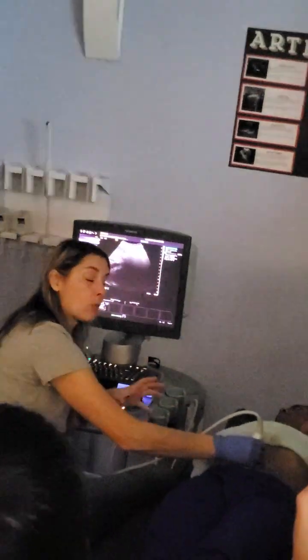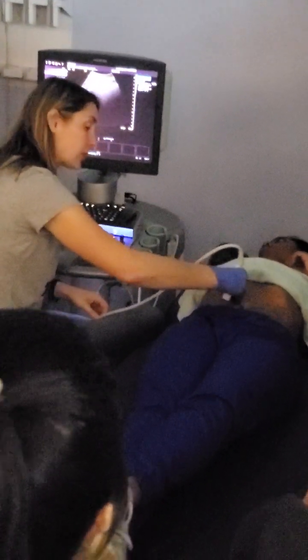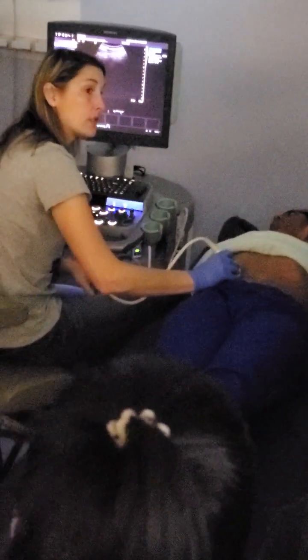Quick breath. One thing that's important to note, kind of like we talked about with the kidneys, if I can use the liver window, I will. So with her gallbladder, what I'm going to do is come out laterally and then scan back towards it to see if I can get some liver between my transducer and the gallbladder to clean out the fluid.